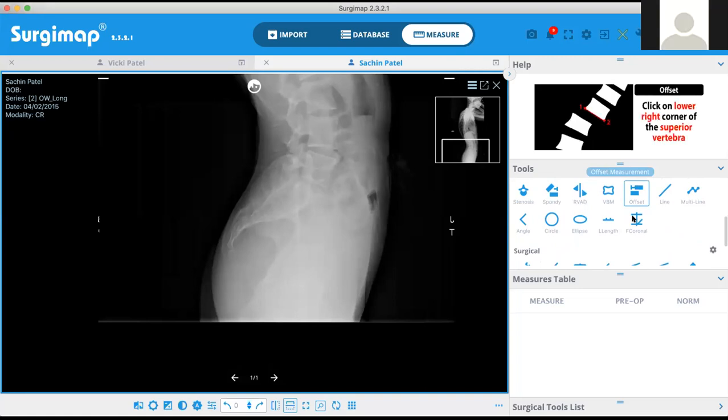Yeah. So this is as per the Lenke classification, but this does not mean that the true kyphosis is this much. The true kyphosis of the thoracic spine is from the end vertebra to the end vertebra of the thoracic spine. But this is just to make the classification more reliable and have better inter-observer variability. Otherwise, people will just start measuring whatever they feel.